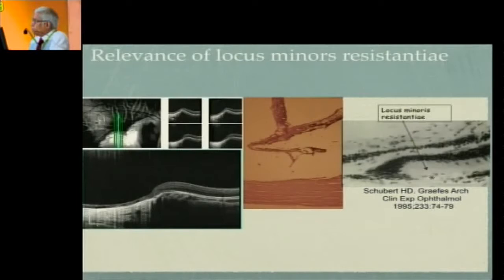You can see on the OCT that this is the retina of normal thickness, and the inner layers are continuing as the fibrotic intercalary membrane beyond the coloboma margin. But the outer layers are actually turning back and joining the retinal pigment epithelium. Histopathologically, sometimes you can actually see a double layer of photoreceptors at this point, because there is one layer here and another layer which has turned back.